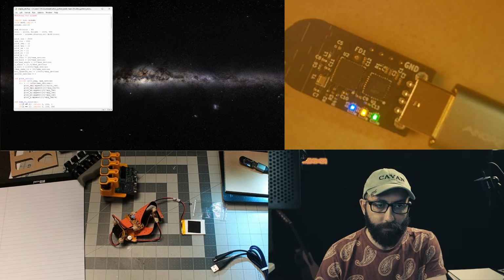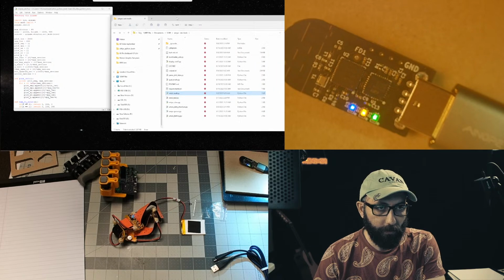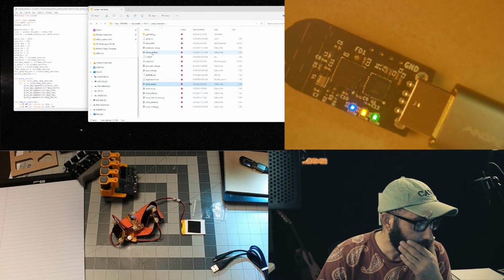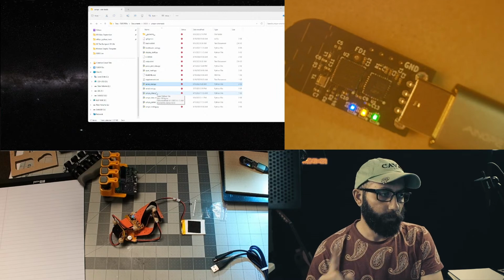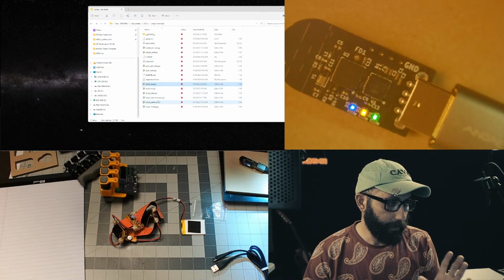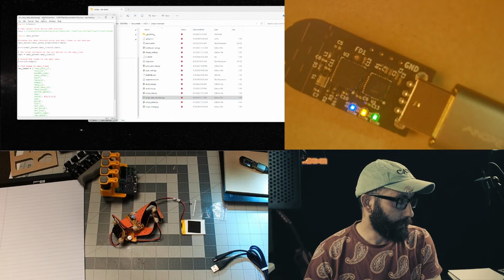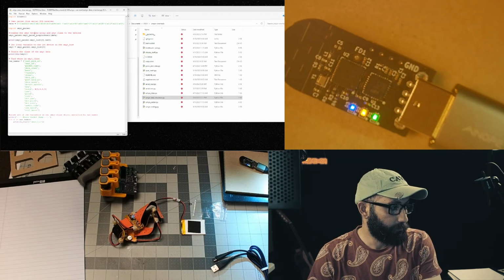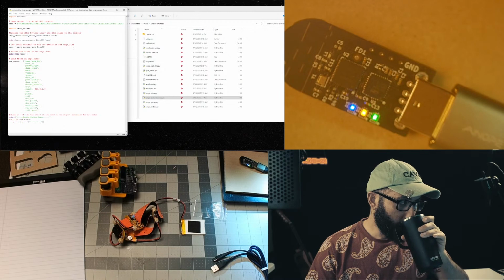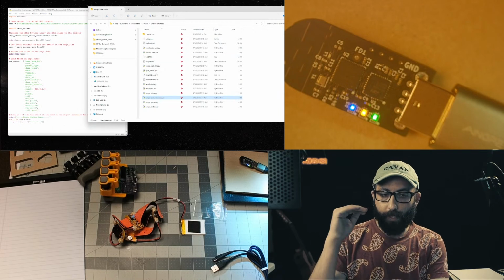I'm going to use the code I did yesterday because I made some progress. So we're going to stick in the uMyo tools. And I won't be messing with the new code that 3D6 has just yet. I will take a look at it, but I wanted to get this. So what we did yesterday is we did a uMyo data structure. So we took the code and we wanted to glean the information from it, right? So we're able now to pull out the information for each packet, because we want to record this into a CSV file.